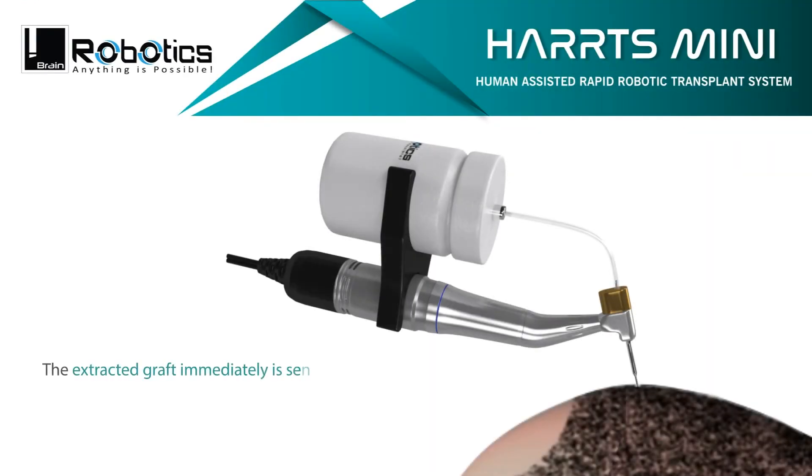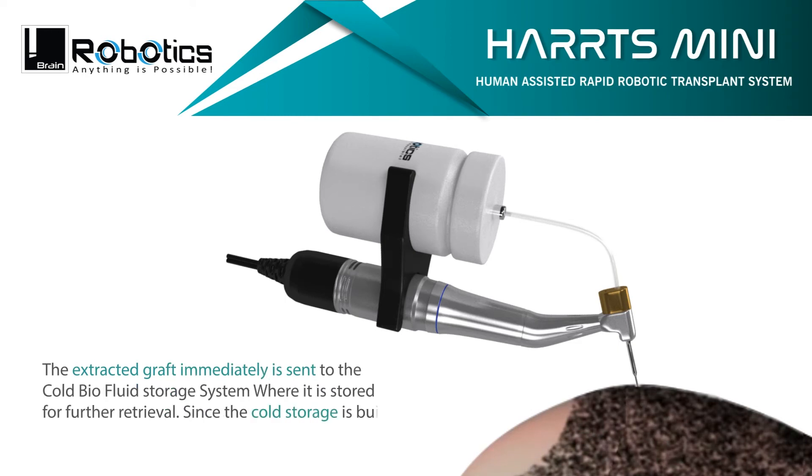The extracted graft is immediately sent to the cold barrier fluid storage system where it is stored for further retrieval. Since the cold storage is built into the handpiece, there is no desiccation of the grafts while traversing.